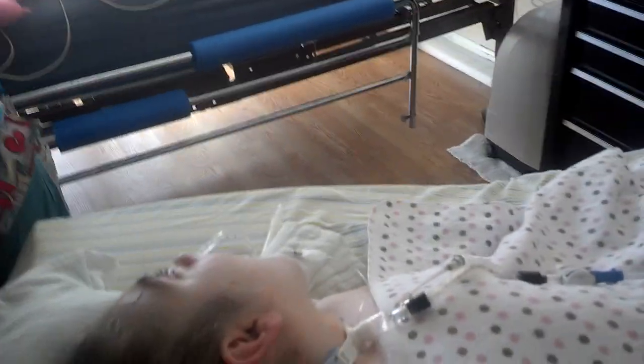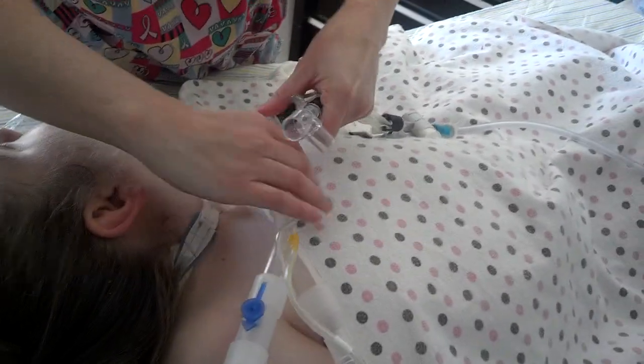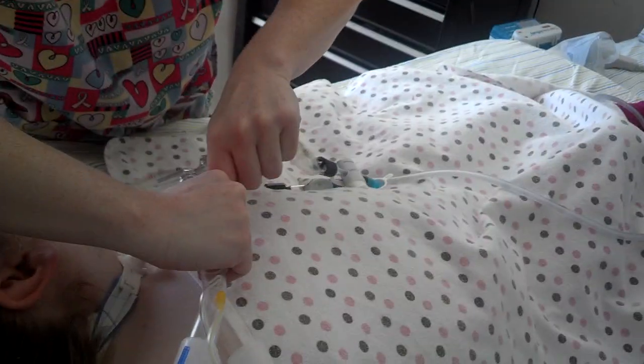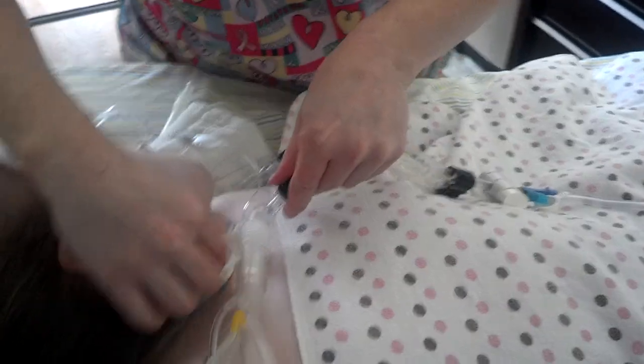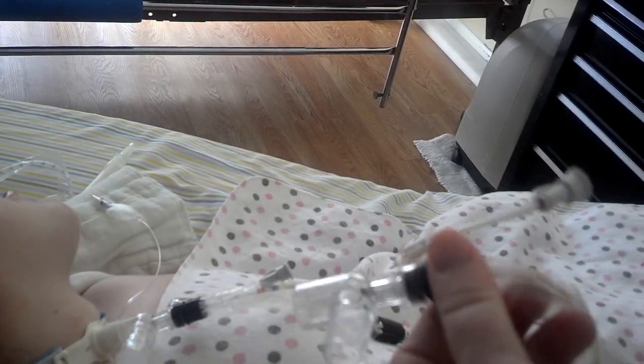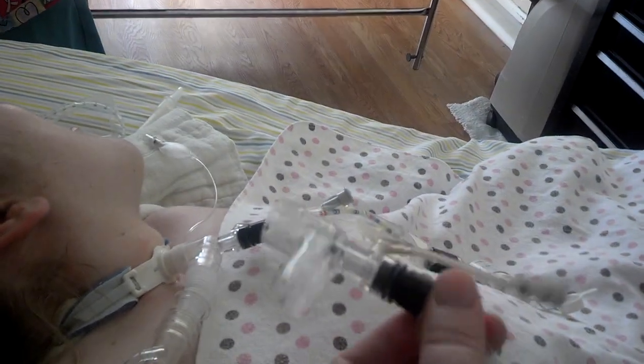Now she's just going to change the Ballard out. We always silence the alarms. Changing the Ballard is as easy as that. So you have an L joint basically — the one where the suction catheter would be going down goes to the patient, and the other side goes to your tubing.